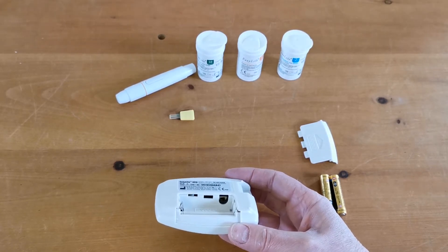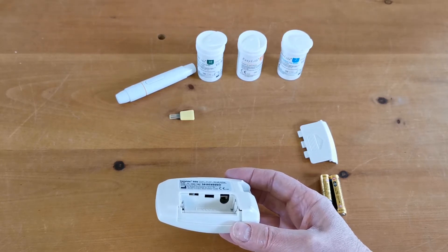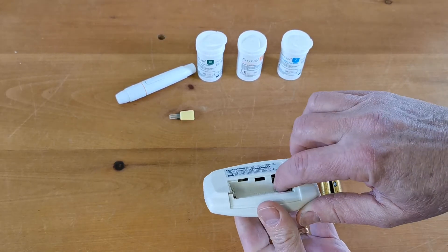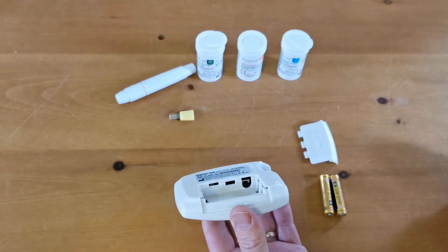This meter has the ability to be switched between milligrams per deciliter and the more familiar UK units, millimoles per liter. In the left hand setting, which most meters come as default, the unit will display in milligrams per deciliter.